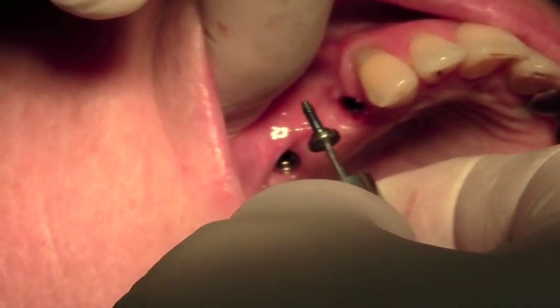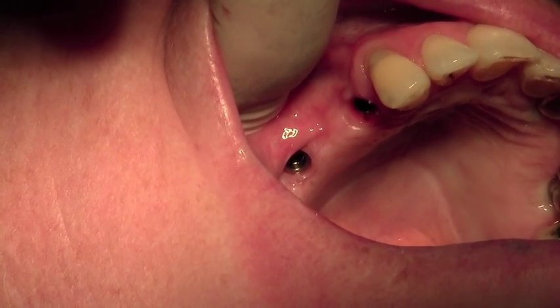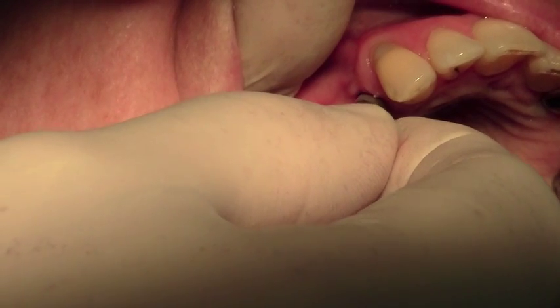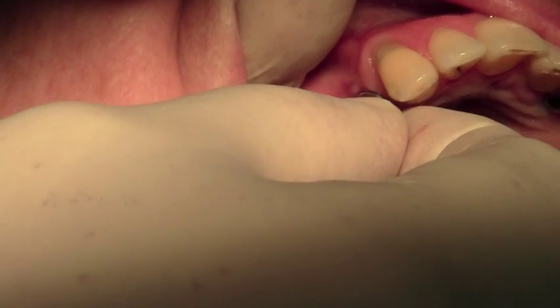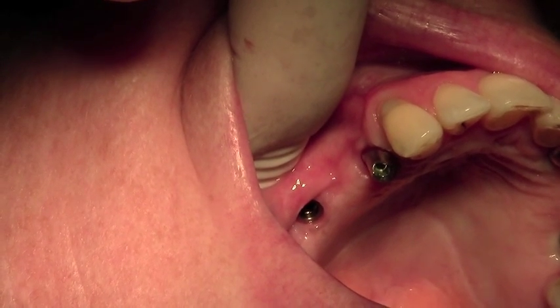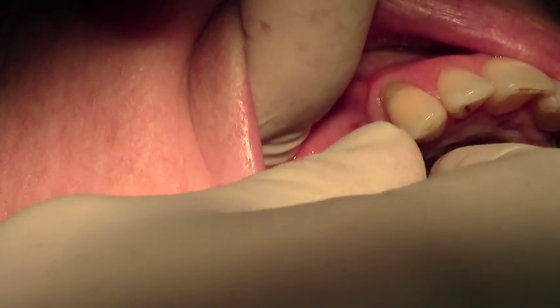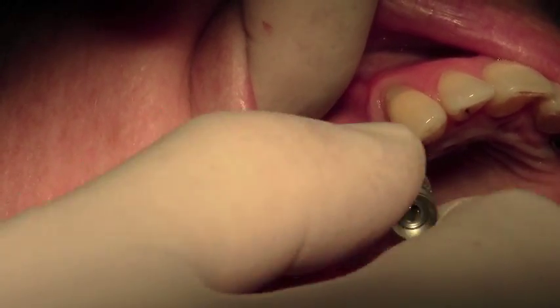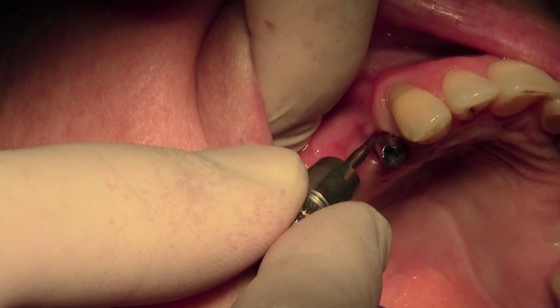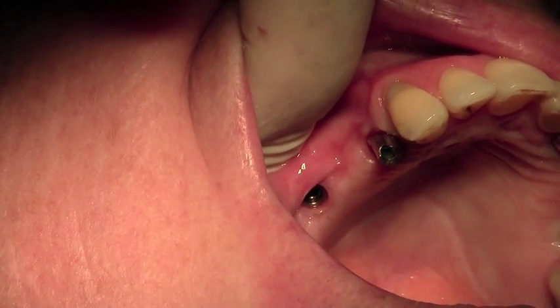This is the wider 4.5mm diameter. Next we're going to put the titanium milled abutments in place, and you can see the beautiful marginal adaptation — it seats really very positively down, using the 1.2mm driver. I'm just going to tighten that down, just hand tightened — that's all it needs to be. You've got a little orientation mark on the buccal surface that the laboratory put in, just to help us orientate.